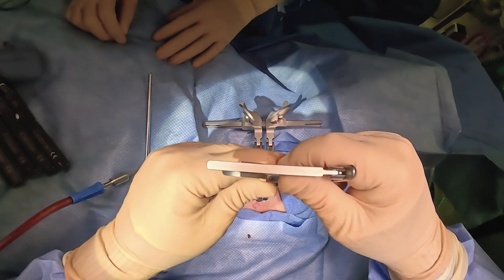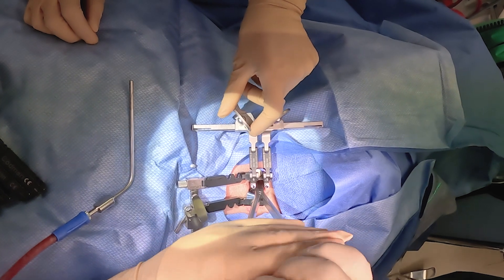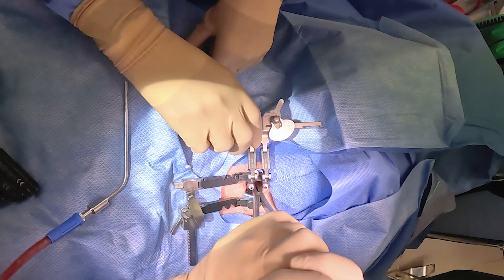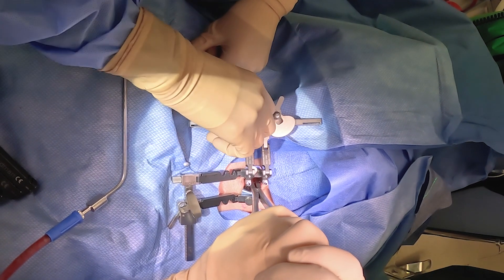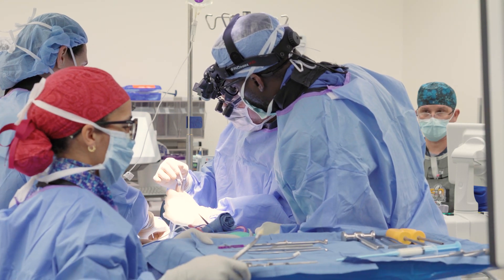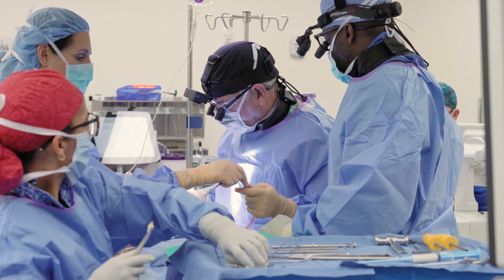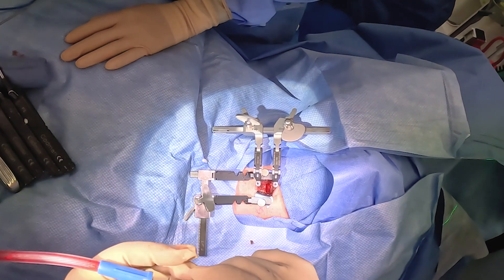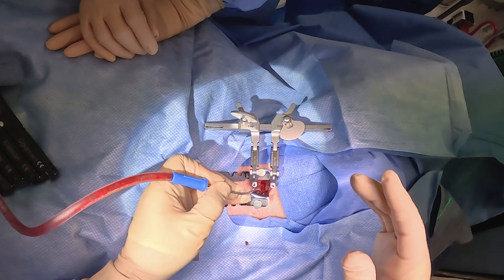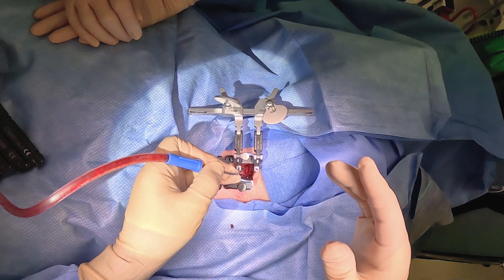One of the hallmarks of disk replacement is parallel distraction. You can see here I let down the distraction and then I'm using this intervertebral spreader to do all the work, and the pins will just hold it. At this point they become retaining pins, not distracting pins. The distraction maneuver was with that intervertebral distractor. And now we've got a really nice situation to put in a new disk.